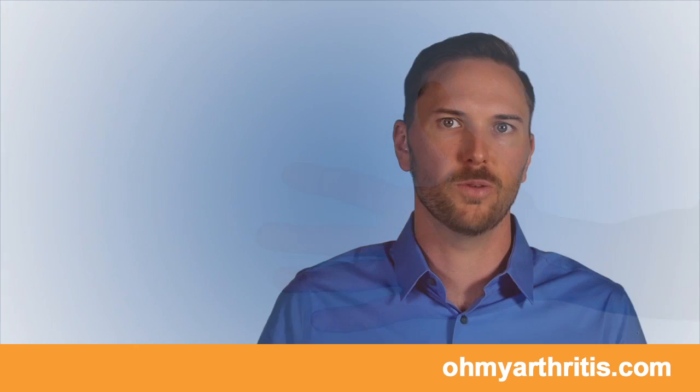Best treated early before the thumb gets stuck in a bent position, trigger thumb may be treated with a splint that limits or blocks the thumb from bending to allow it to rest.